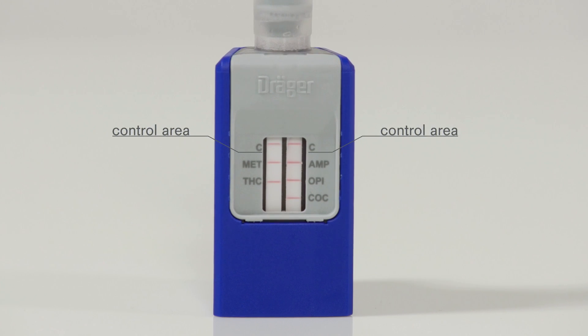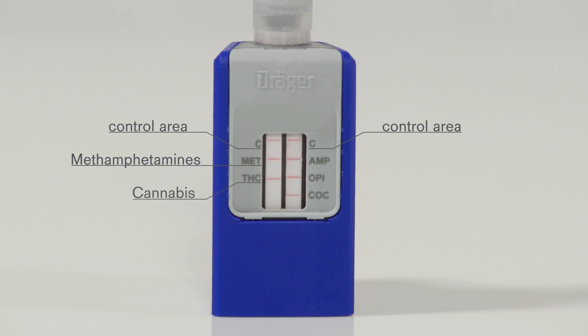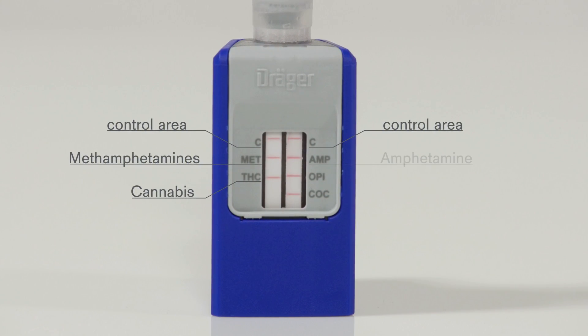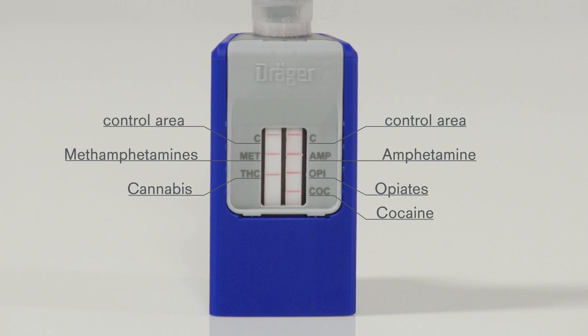On the left, MET stands for methamphetamine, and THC for the active ingredient in cannabis. On the right, AMP stands for amphetamine, OPI for opiates, and COC for cocaine.